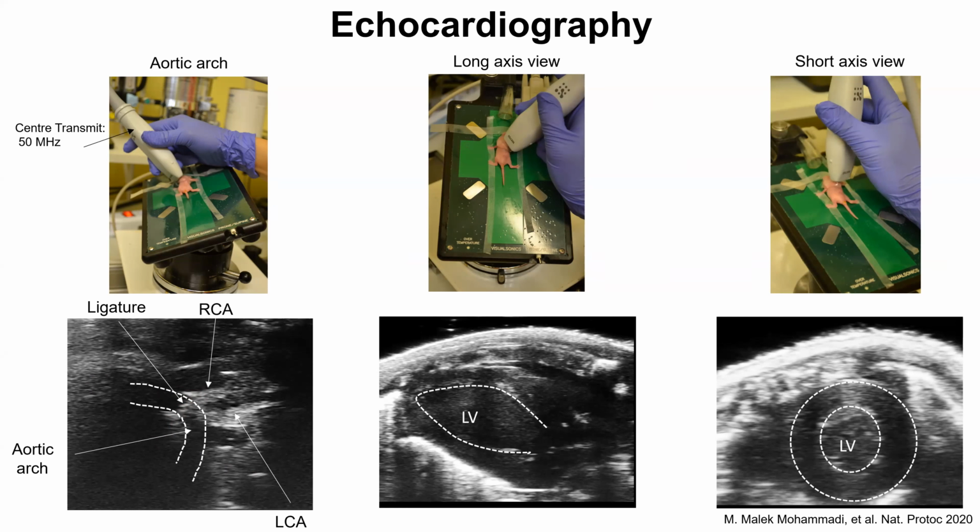And you can also analyze the data and make sure that you are using consecutive systolic and diastolic areas and at least 3 heartbeats per mouse. And after you are done, you can just record the videos and continue. Just remove the gel and gently remove the tapes and place the pups back in the mother's cage.